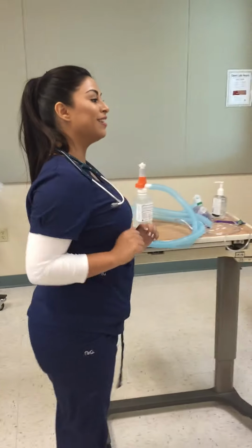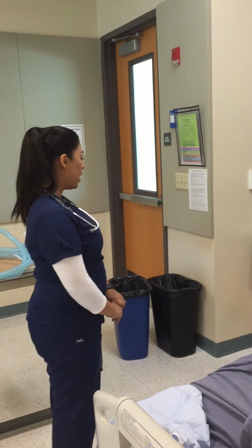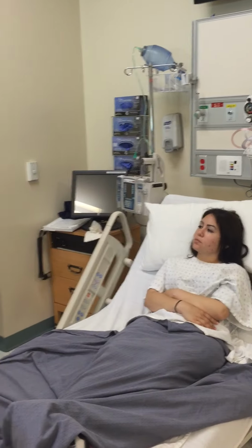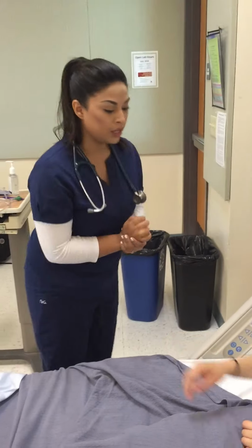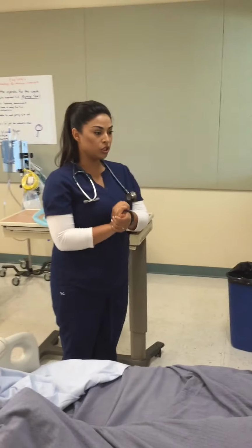Knock knock. Hello, hi, my name is Brianna. I'm a student with the respiratory department. Before beginning, can I get your first and last name and date of birth? Okay, great. Just let me wash my hands really quick. Can I go ahead and see your wristband as well? Okay, great, thank you. So today I'm going to be adding some humidity to your oxygen.